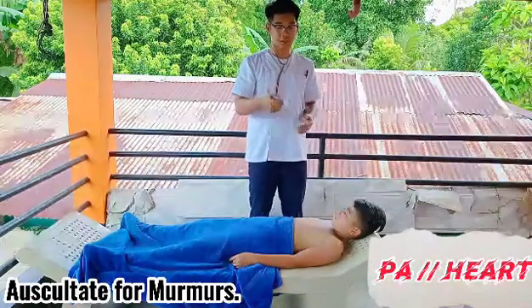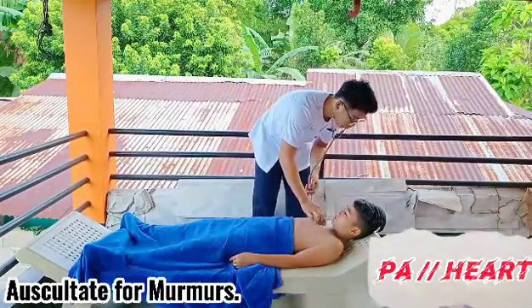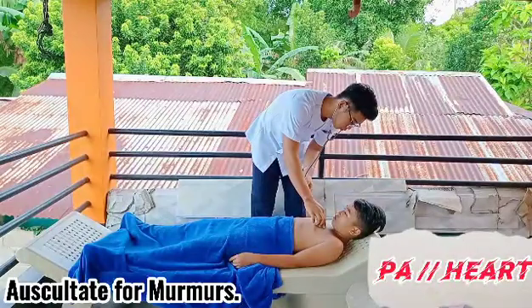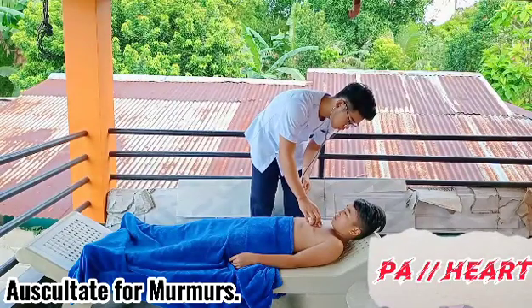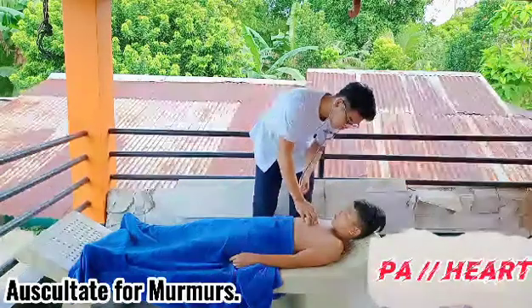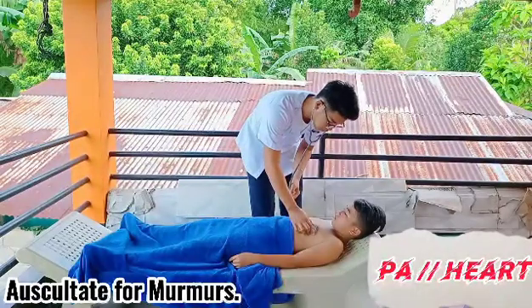Alright, let's repeat it again using the bell of the stethoscope. And the mitral area.